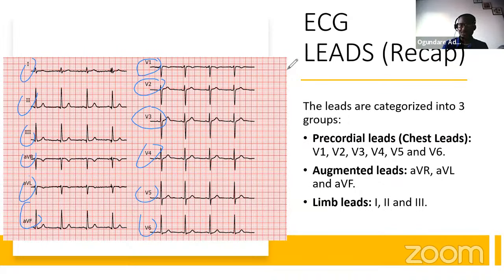So when we are now talking about the clinical scope, it's a factor of knowing where V1 is showing, where V2 is showing, where V3 is showing, where AVR is showing, and we can start making sense out of the whole stuff.